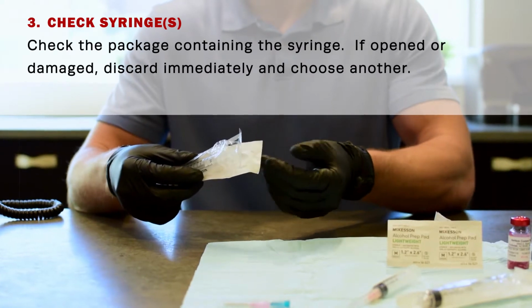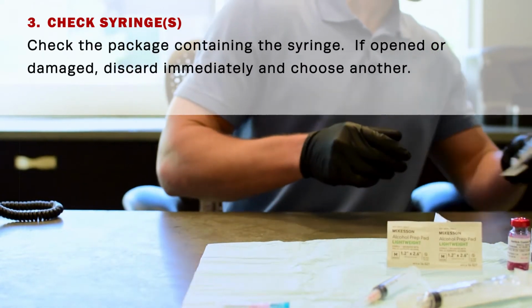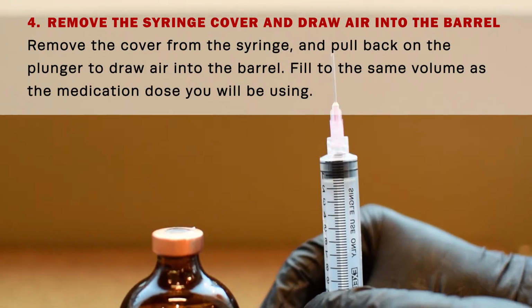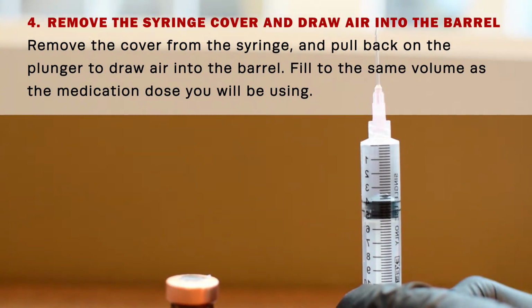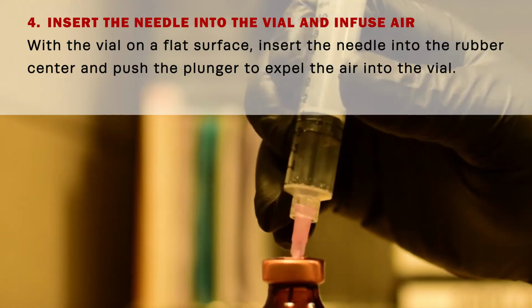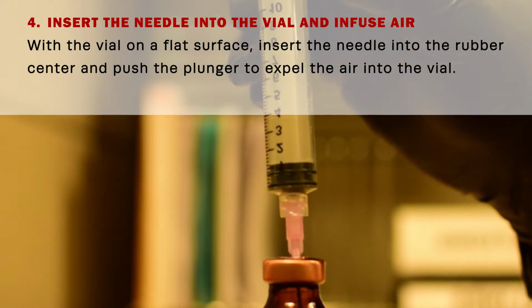Check the package containing the syringe. If open or damaged, discard and choose another. Remove the cover from the syringe. Pull back on the plunger to draw air into the syringe. You want to pull back to the same volume as the dosage of medication you will be using. With the vial on a flat surface, insert the needle in the rubber center and push the plunger to expel the air into the vial.